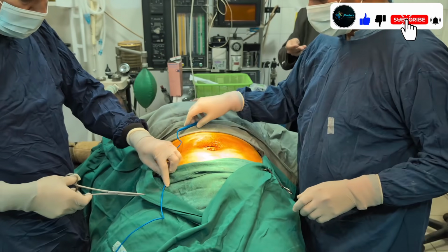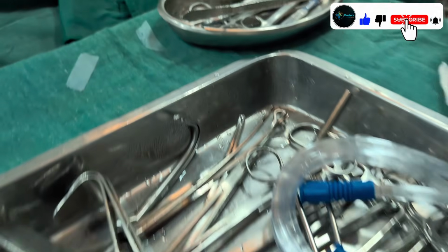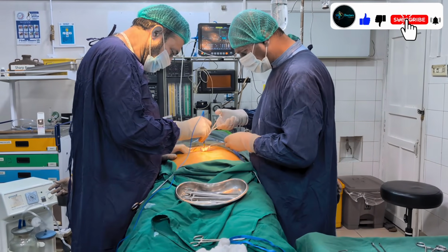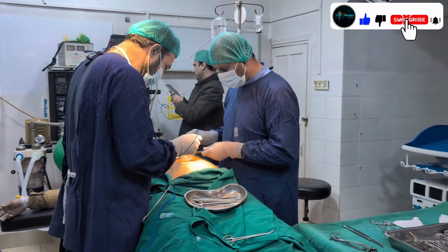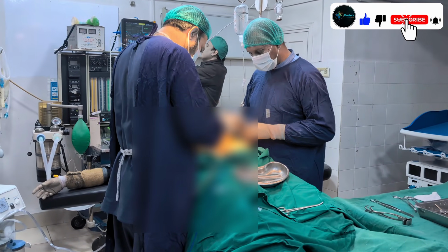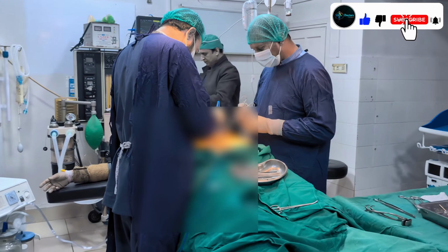These are the cartridges we will be using for making the incision and for controlling bleeding. Some blood vessels can bleed during surgery, so we use this to stop the bleeding and to reduce the chance of complication. The surgeon has made the incision and is now using the cautery. As you can see on the camera, this is the assistant helping the surgeon.